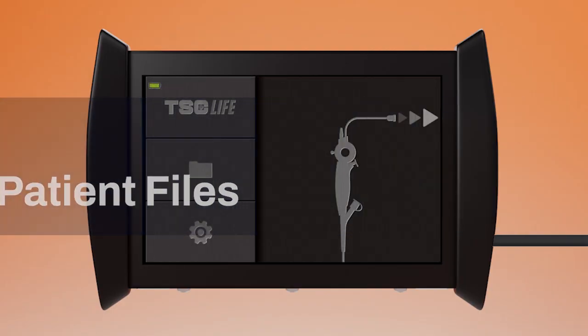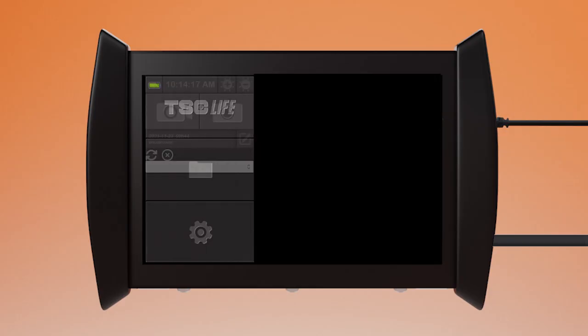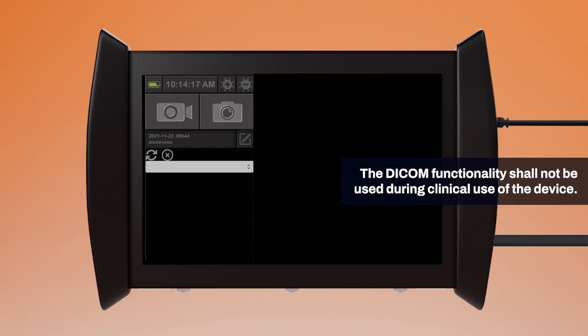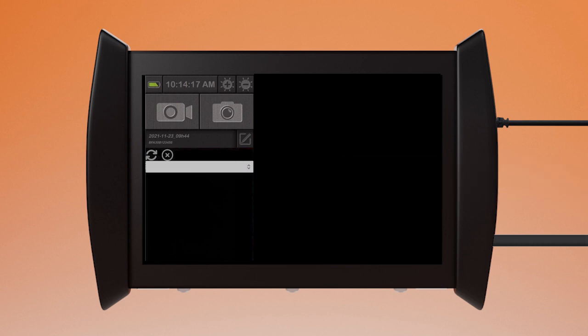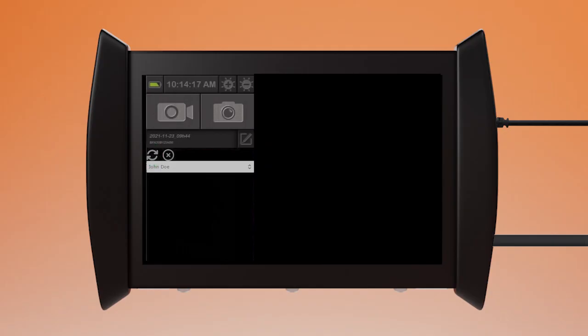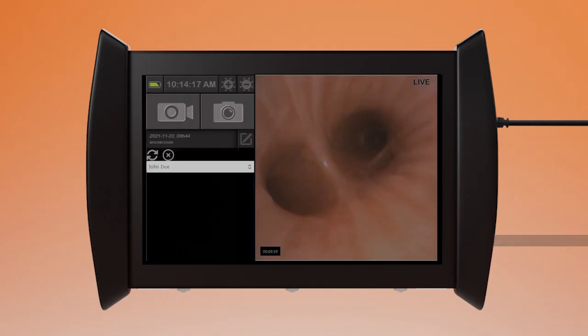Once your worklist and PACS are configured, connect your endoscope. Retrieve the worklist info before inserting the endoscope in the patient and disconnect your network cable. A new drop-down menu will appear, showing all patients from the worklist. Select your patient. You can refresh the list or clear the selection at any time.